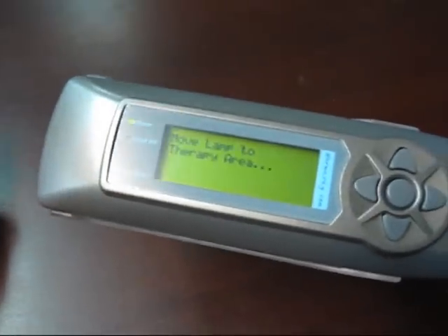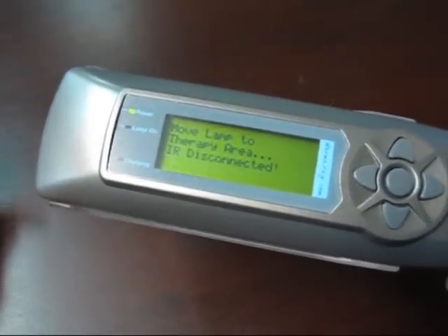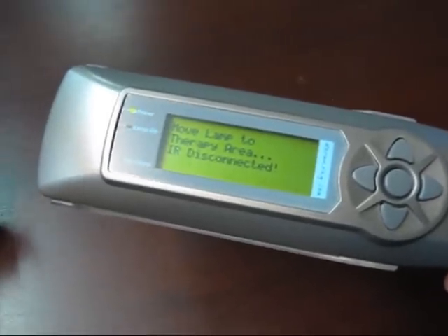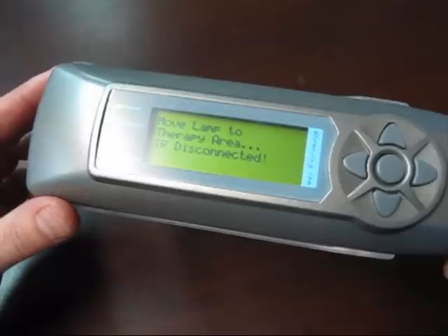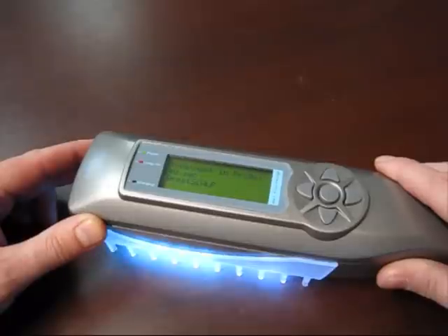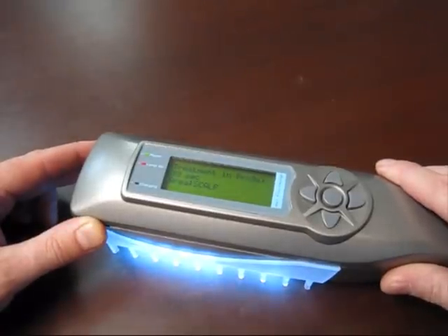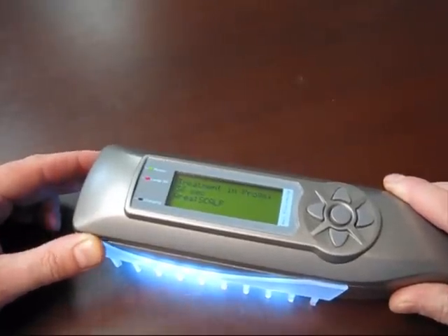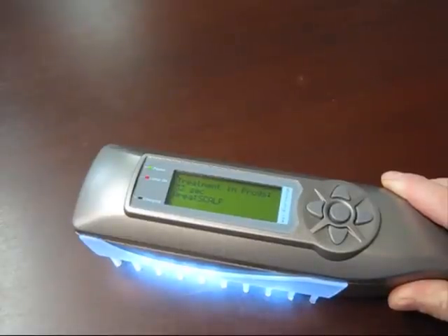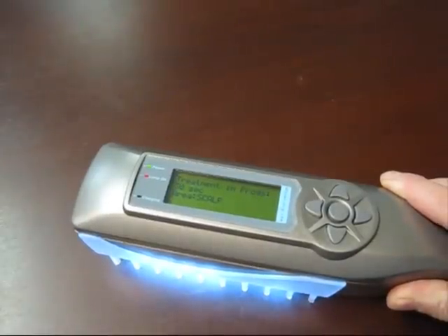Now this will run through the next treatment for the patient Nick, through all the areas, and we already set up scalp and elbow. So it's asking me to move to a treatment area. It's now started treating my area, scalp. And because of my skin type and the disease I'm treating, it's allocated about 35 seconds for the first treatment.